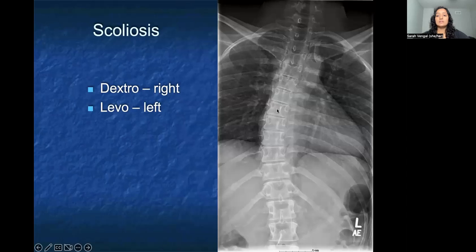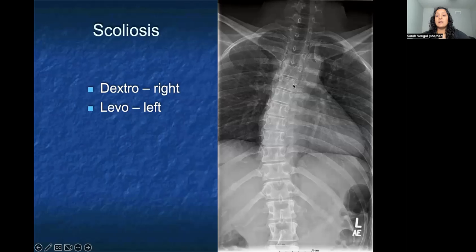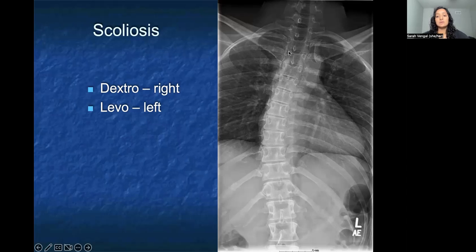Looking at this thoracic spine, you can see that the spinous processes do not follow a straight line — in fact, it seems to curve to the patient's right. You can see that this patient is probably not rotated because the pedicles, like owl eyes, appear to be looking directly at you. This particular patient is curved to the patient's right, which we call dextroscoliosis. If the spine curved to the left, we would refer to that as levoscoliosis.